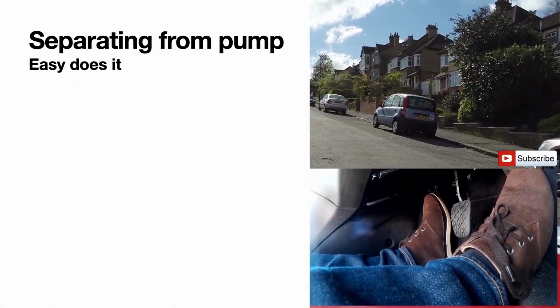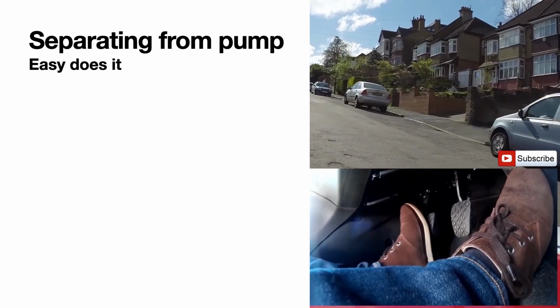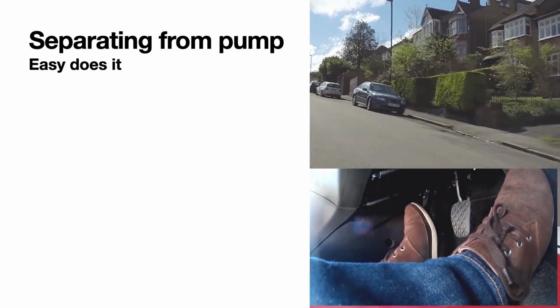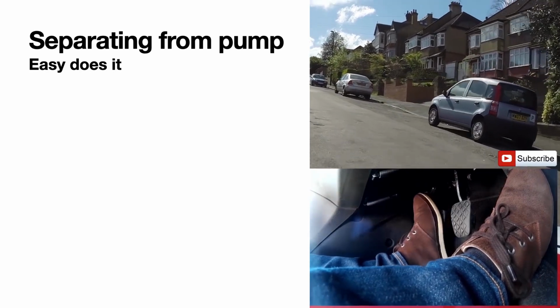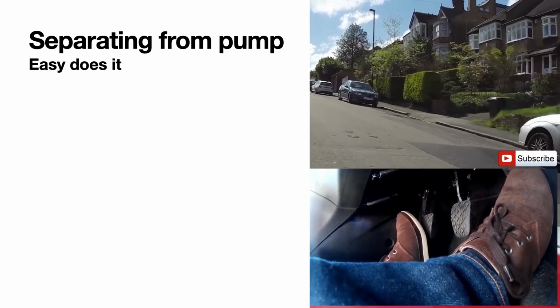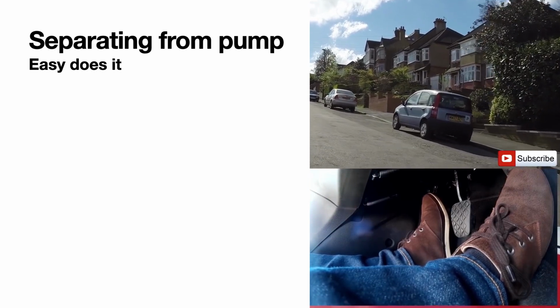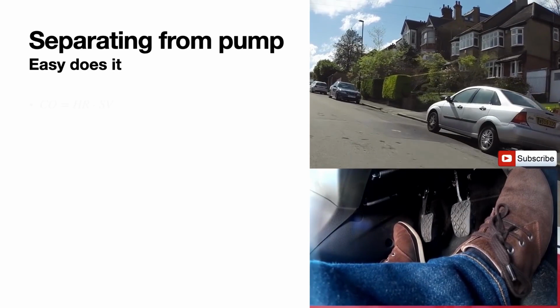At my institution, the anesthesiologists are generally responsible for transitioning the patient from cardiopulmonary bypass back to spontaneous circulation. This practice may not be universally true. My opinion is that since the anesthesiologist is responsible for the hemodynamics and physiology post-pump, it is entirely appropriate that the patient be separated from bypass on the anesthesiologist's terms. But practice patterns do vary from institution to institution.